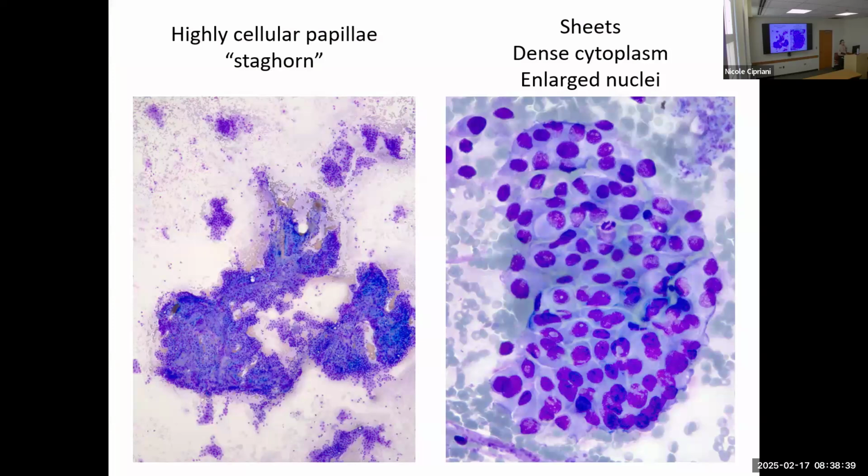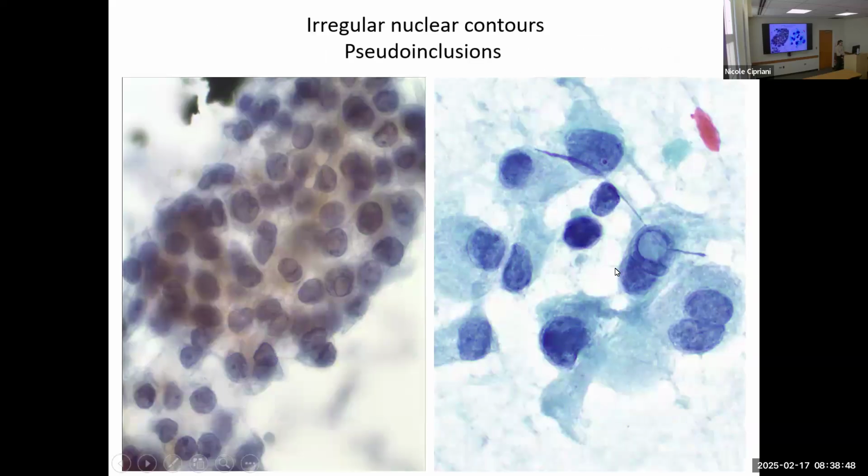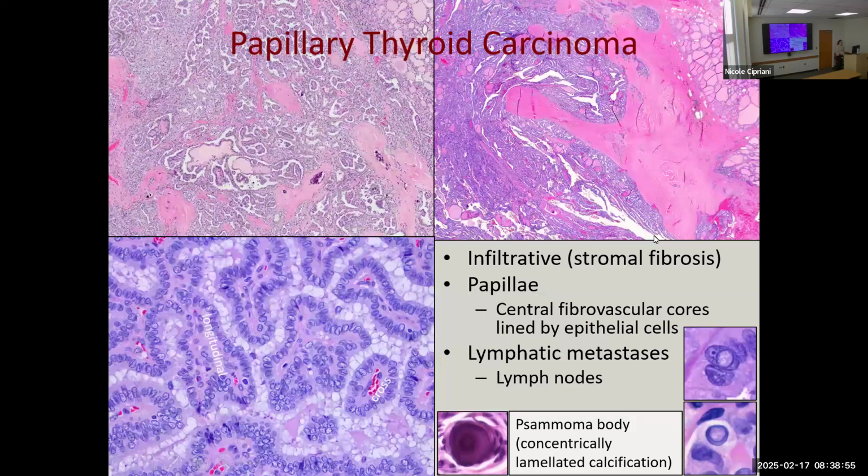Okay. All right, moving on into our FNA categories of highly cellular, but also with nuclear atypia, nuclear enlargement, and our favorite diagnostic feature of papillary pseudo-inclusions, right? So then we have PTC, and you all know PTC very well in its classic form with papillae, with nuclei surrounding the papillae that have these atypical features, right, which are enlarged, overlapping, grooved, wrinkled, chromatin clearing, pseudo-inclusions, all the things, right?